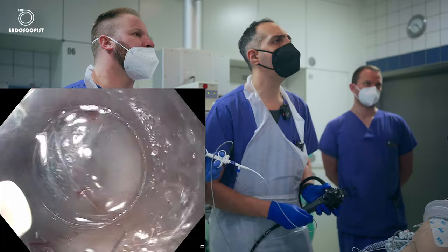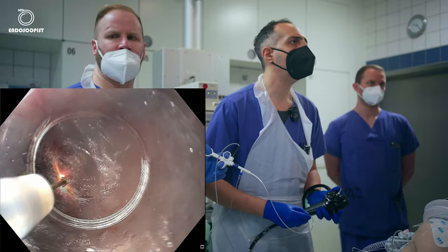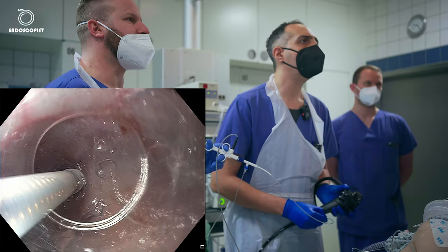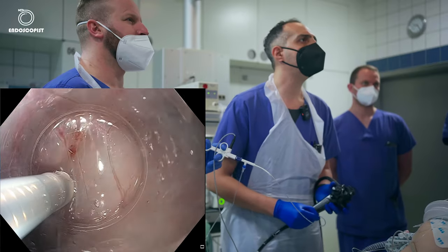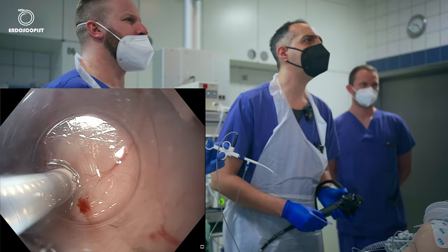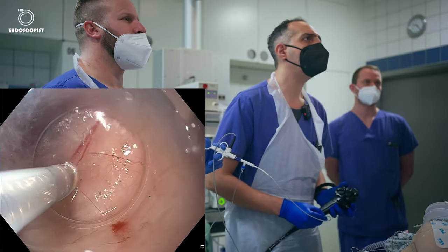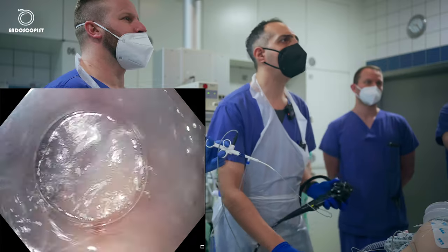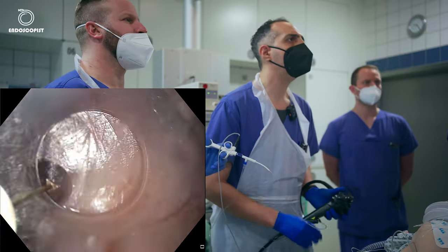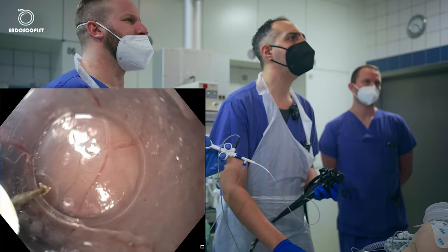I'll continue again. We are doing very fine. We are reaching now the 35 centimeter line. I'm injecting the whole time just to protect the mucosa. Again, I have a very bad area here. I can't see a good separation between the mucosa and the muscle layer.